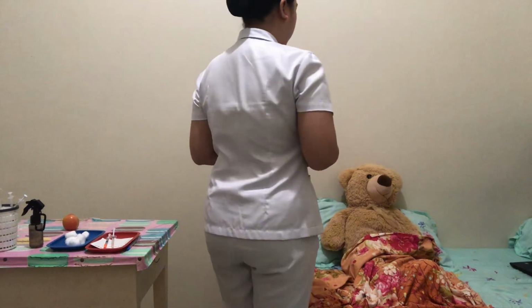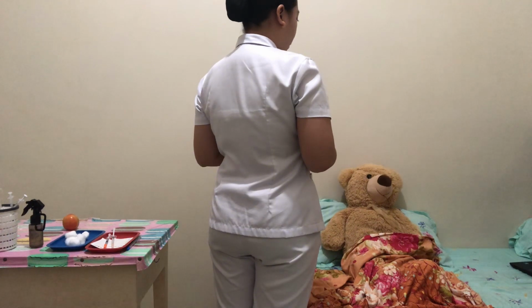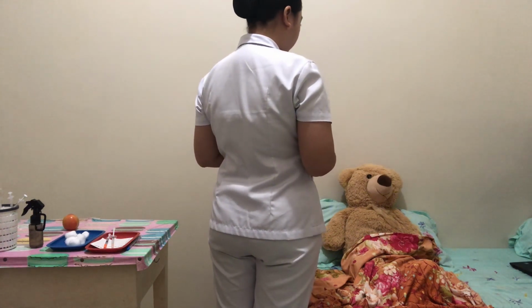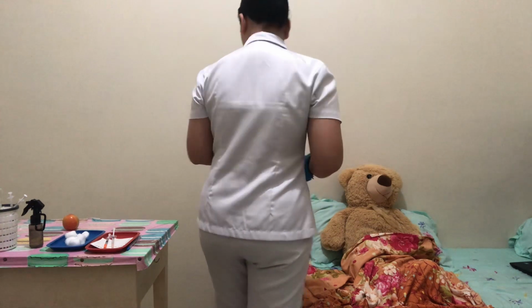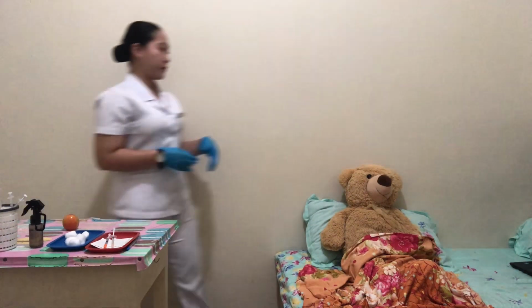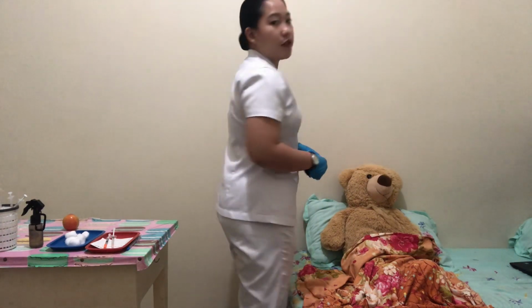Alright, ma'am, today I'll be administering your medication through your parenteral route, and will that be alright? Okay, so I'll be closing the door for your privacy. And also, I have already prepared your medication earlier. So now, assist the patient to a position in which the arm, leg, or abdomen can be relaxed depending on the side to be used.